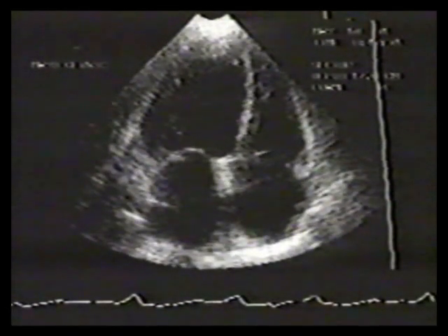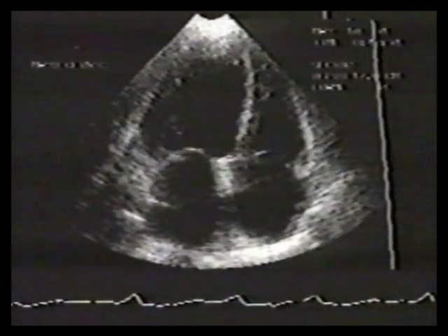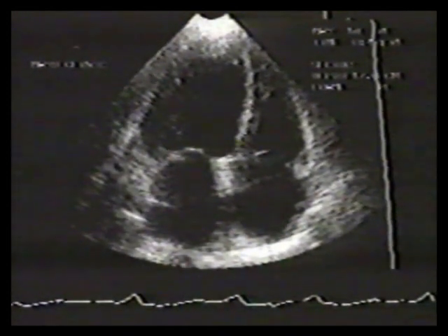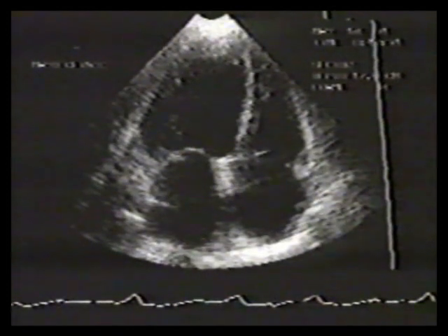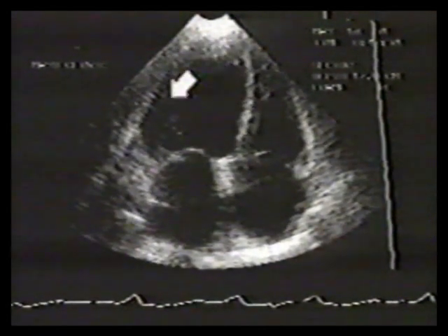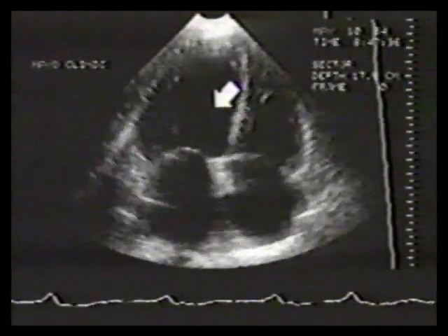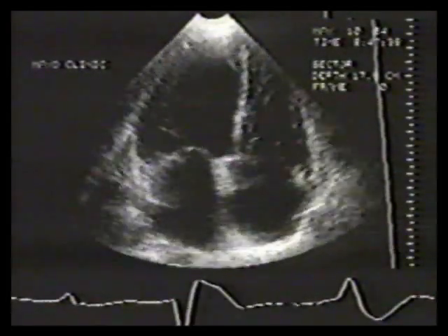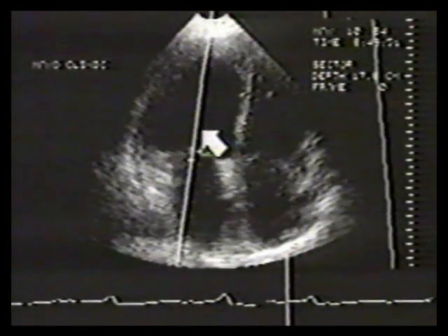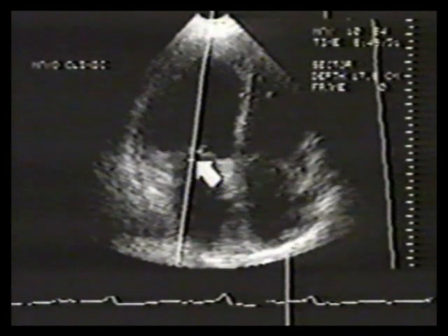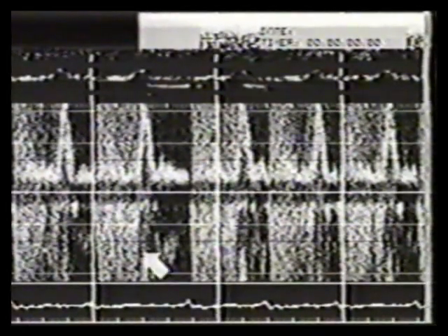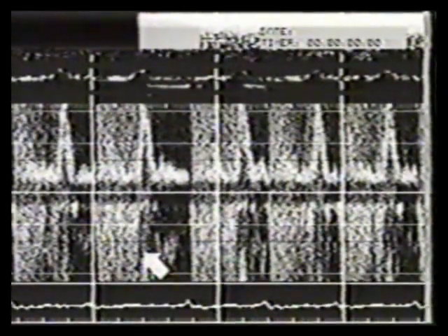Pulsed wave Doppler can also be used to confirm mitral regurgitation and provides a means of estimating severity. This patient has a dilated cardiomyopathy with all chambers enlarged and reduced left ventricular contractility. A Doppler cursor has been placed across the mitral valve with a sample volume just to the atrial side of mitral coaptation. The corresponding Doppler spectrum shows a systolic aliased signal of mitral regurgitation.